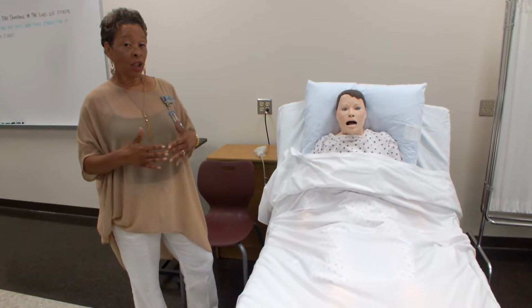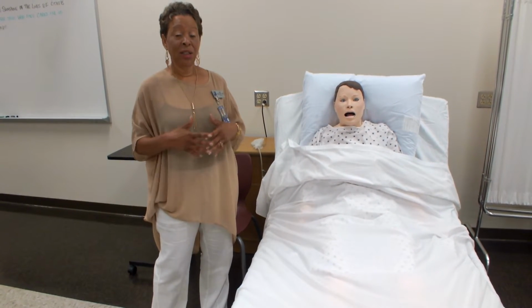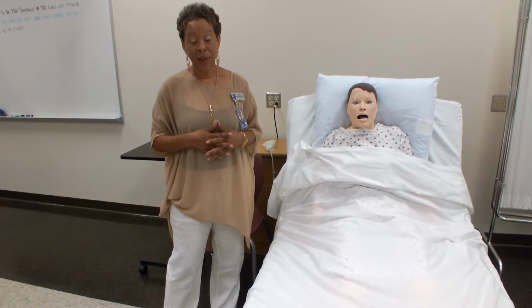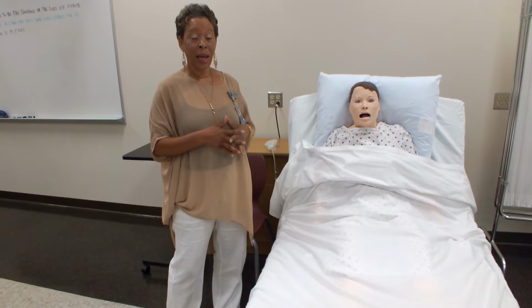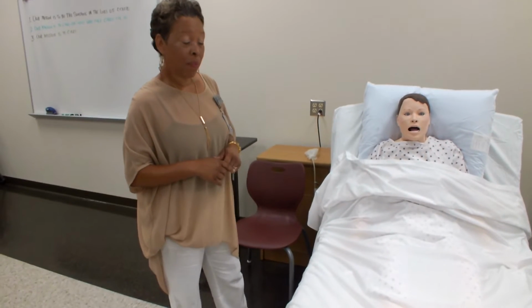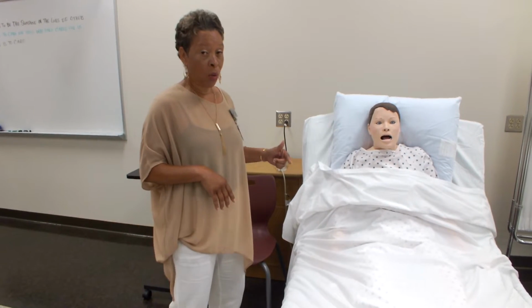Okay, so your Nurse Aide Candidate Handbook tells you to be anywhere between 75 and 90 degrees. But again, what is 75 degrees to you may not be 75 degrees to that NAE. So it is very important that you, the Nurse Aide Candidate, raise the head of bed all the way to 90 degrees, okay? Now, that's it with the head of bed. Again, with this skill, make sure that the head of bed remains raised even after you complete the skill. You do not want to lower the head of bed, okay? Keep the head of bed raised.